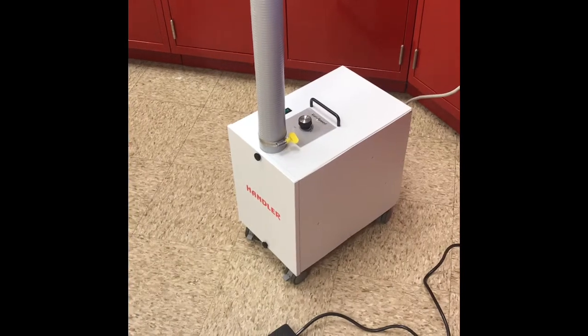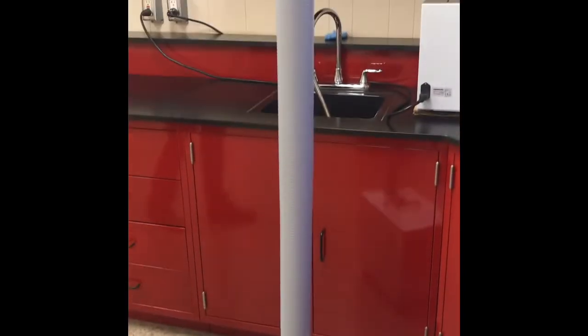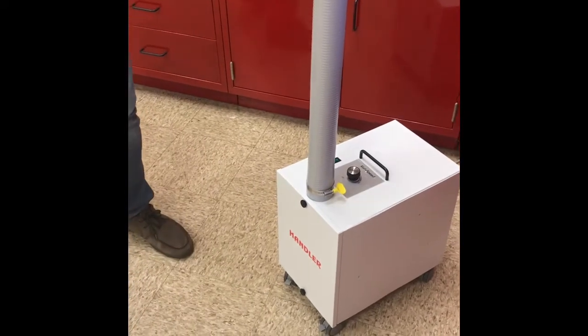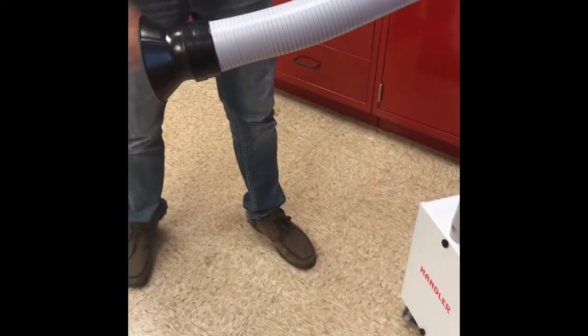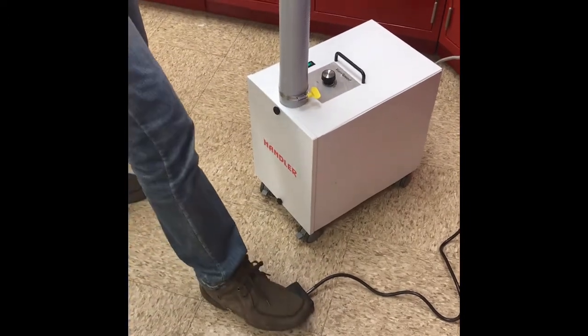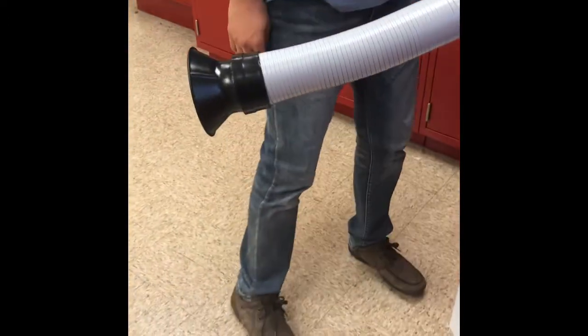Now that the 42 ESU is set up and the hose is attached, when you're ready to work, you simply bend the hose down towards the patient's face, and then press the on-off switch, and you have suction.